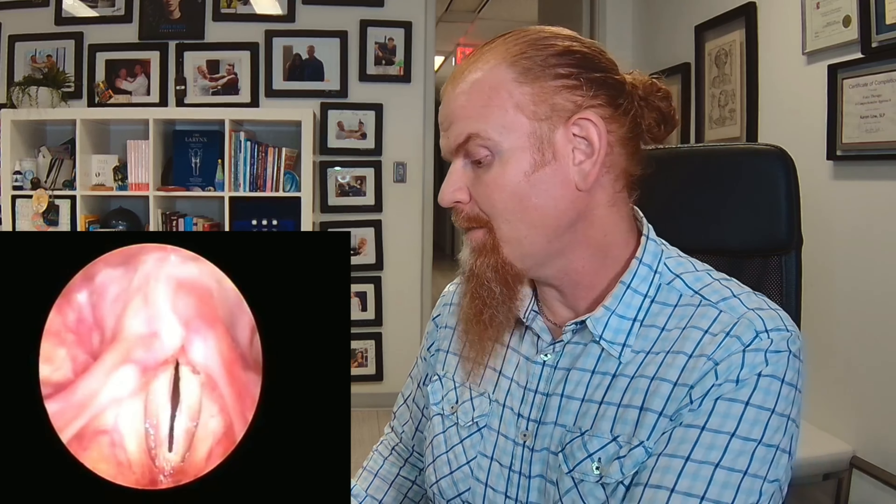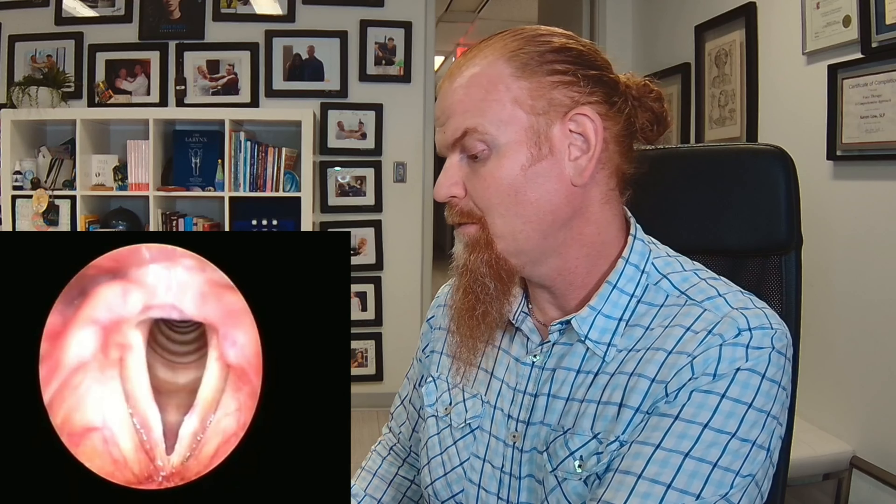Let's watch. We're looking at the vocal cords that are facing us. This vocal cord right here is the right vocal cord. This vocal cord over here is the left vocal cord.